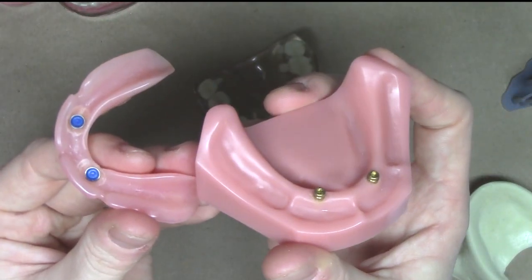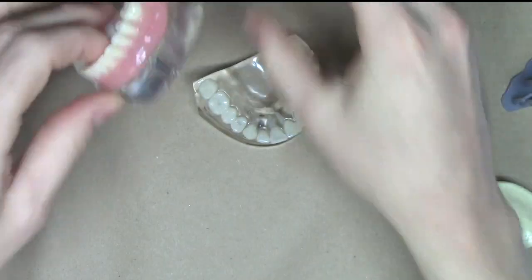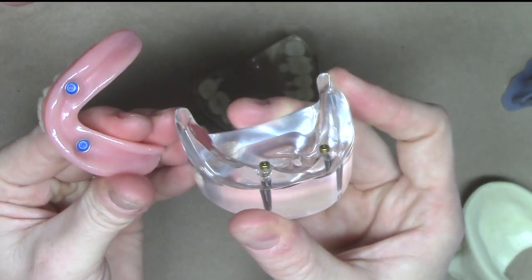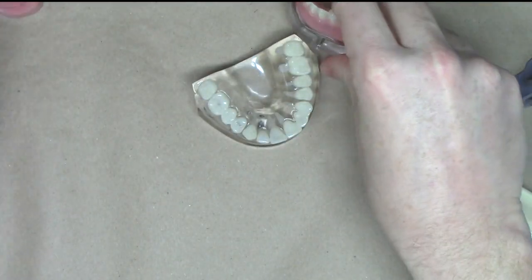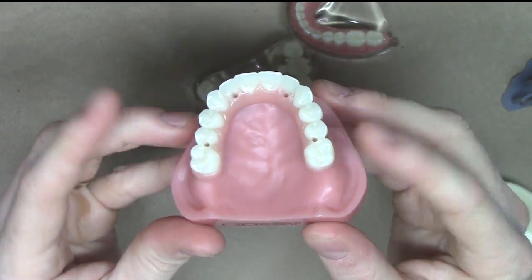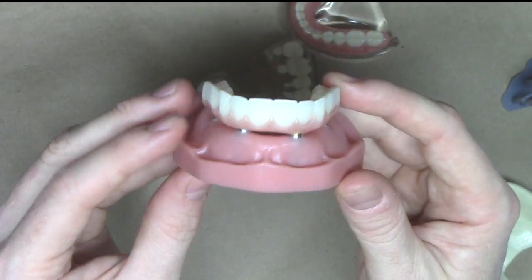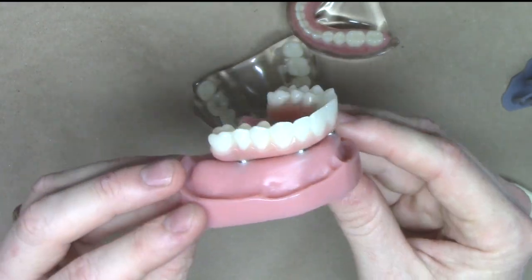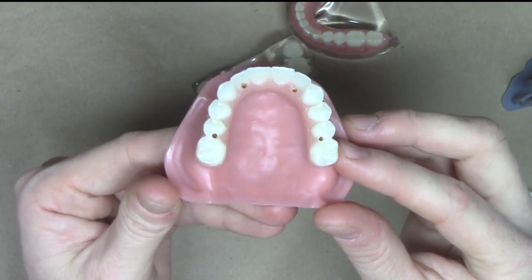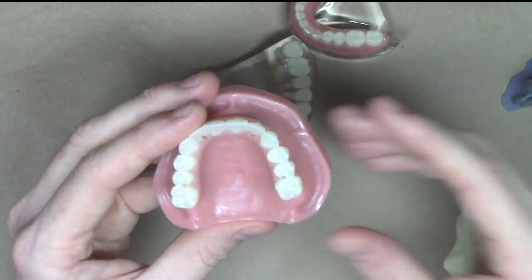If we compare that, of course, to an implant overdenture, we can do that same restoration with a standard diameter implant, as we see right in here. We can also do things like with a bar or a fixed restoration. So as you see here, this is an example of an all-on-4, also known as a DM prosthesis from Biomet 3i or Zimmer-Biomet. This is an option that's available to patients, but seeking treatment for this type of restoration is going to require a standard diameter implant at this time.